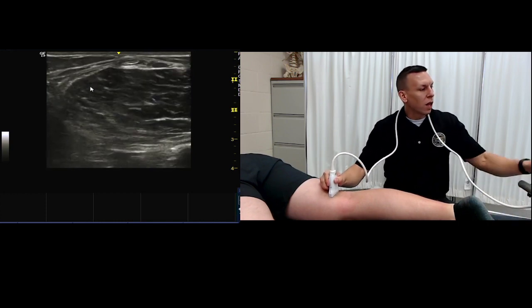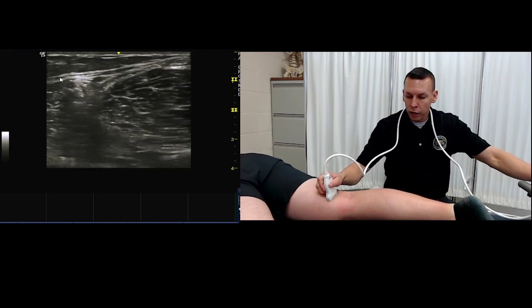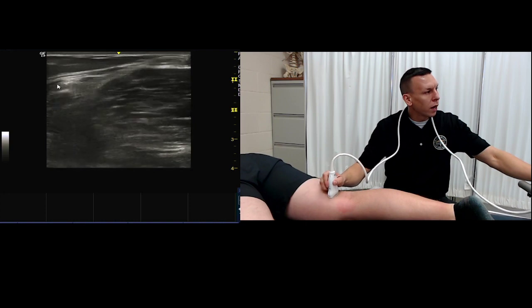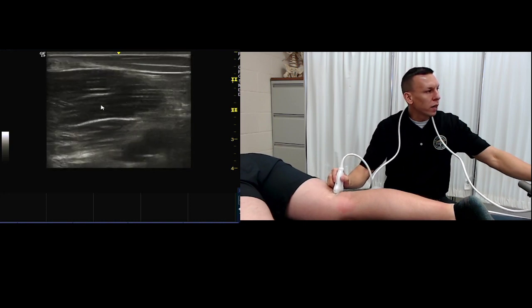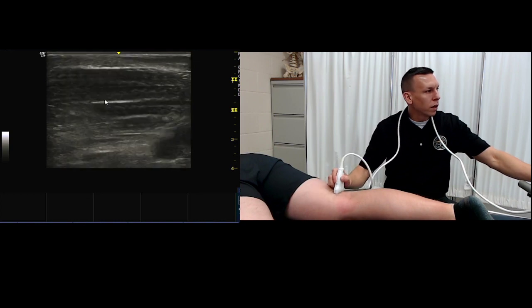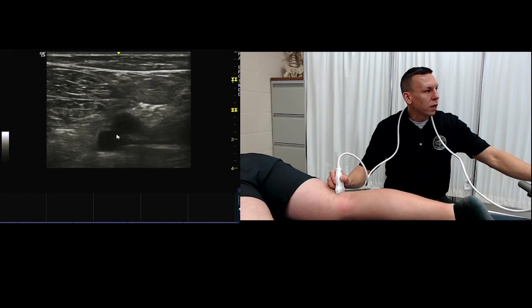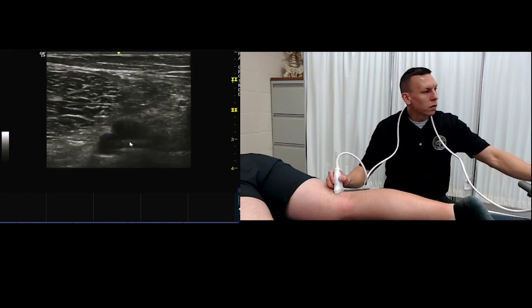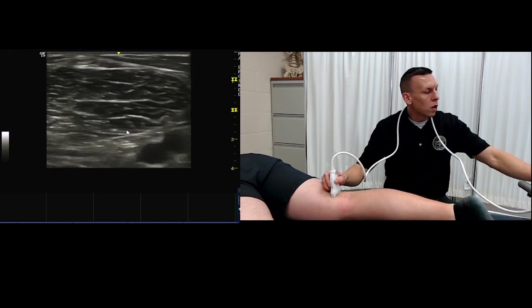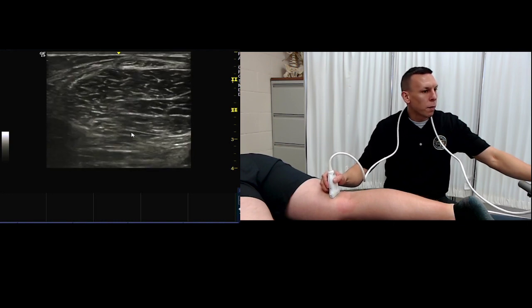And then I like to slide. Just to orient, to the left of the screen is midline or medial, and to the right is lateral. So I'm moving medial to the left, lateral to the right, and this is going to be tough. As soon as you look midline and you're proximal, you might be able to notice the neurovascular structures. But medially, there's a couple of different things we can look for.